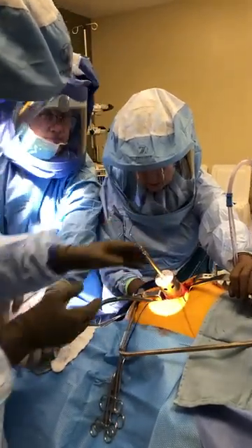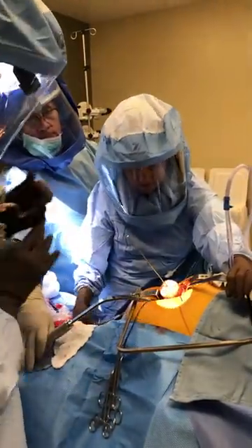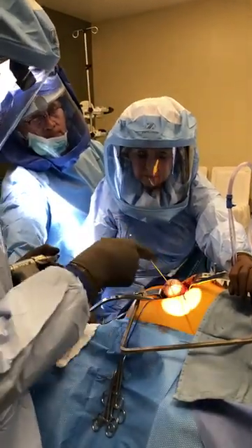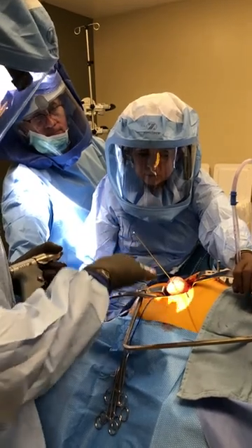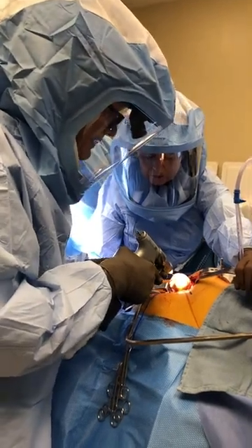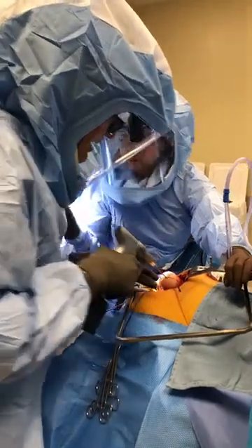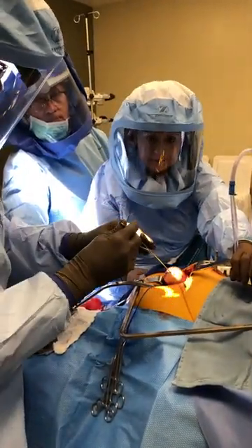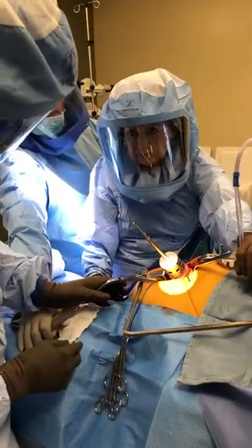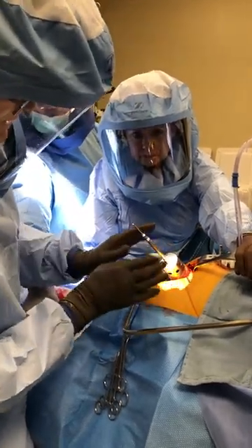But he doesn't have a cam, so I want to take off equal on both front and back. So I'm going to slightly reposition the pin freehand. I don't want to change it in varus-valgus — I just want to change it so that the cut takes a little bit more off the anterior. So just pull it back a little bit, drop my hand a little bit, and re-engage. I'm just fine-tuning the cut. Now I'm taking a few millimeters off the front and a few millimeters more off the back — it's a little bit more balanced.